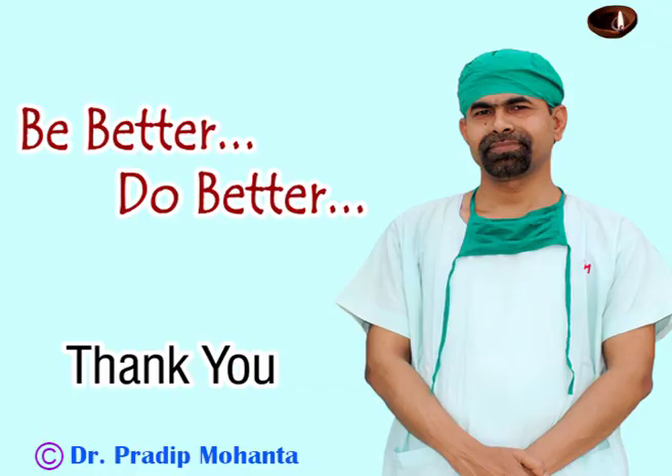This is a totally unedited surgery. Thank you very much for your attention. Hope this video will help you in developing your surgical skills. Be a great surgeon and serve your patients with love, respect, empathy, and great surgical competence. Please do not hate the Simcoe — it is a much safer instrument than the bimanual irrigation aspiration device.